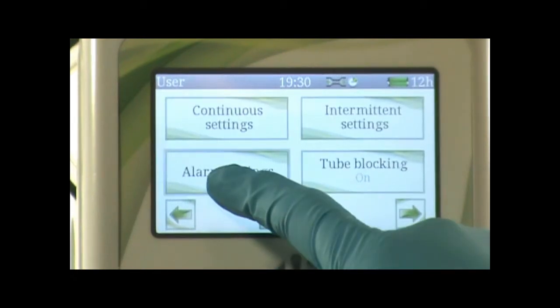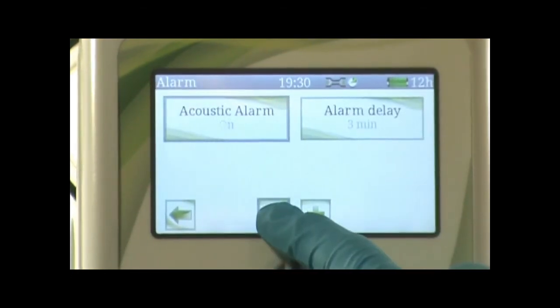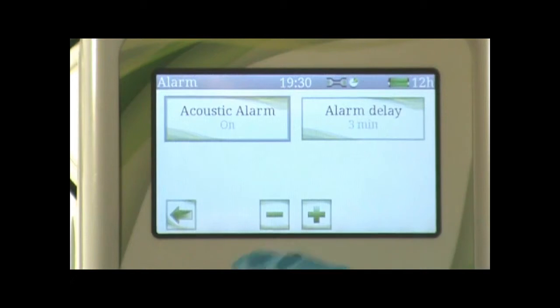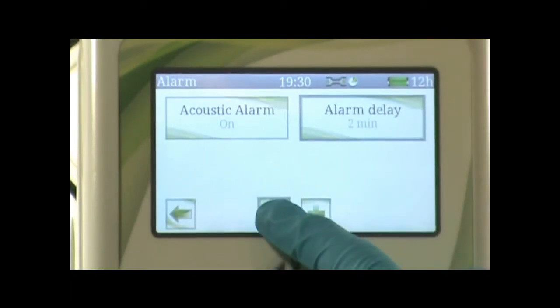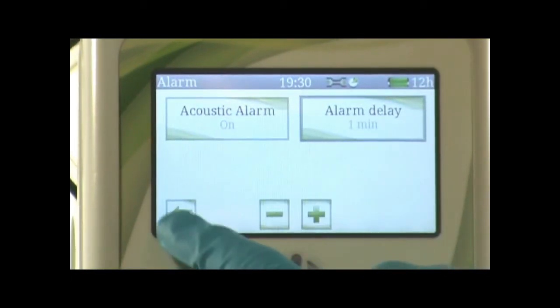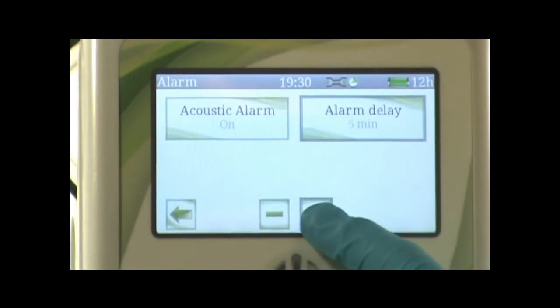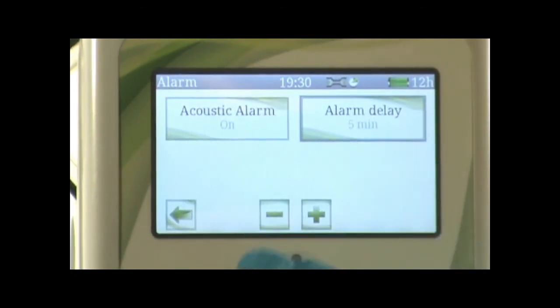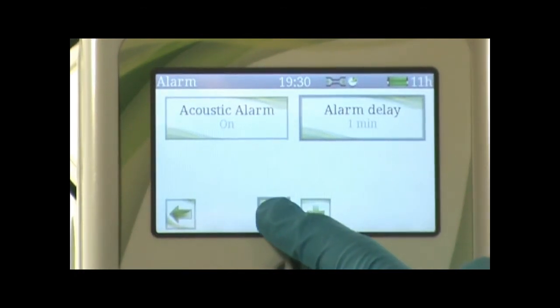To set up acoustic alarm, press the menu button, then user settings, then alarm settings, then acoustic alarm. Press the minus or plus button to enable or disable acoustic alarm. Press alarm delay, then press the minus or plus button to adjust settings for your alarm delay. This can range from five minutes all the way down to 15 seconds.